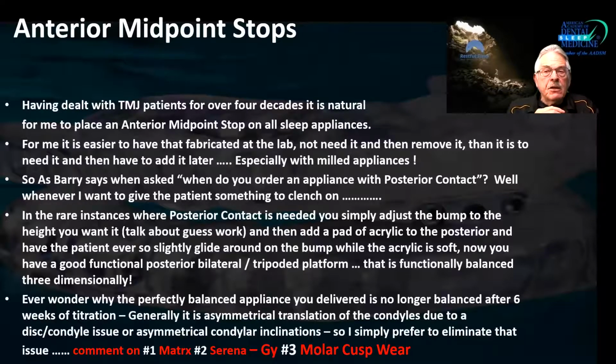I don't know if that's because you've reached a more therapeutic sleep position sooner, or if you've captured the bite registration closer to the therapeutic position and you're only tweaking it 0.5 millimeter one way or the other to get the SpO2 values where you want them.